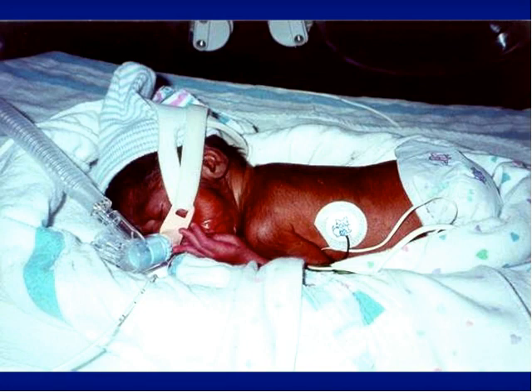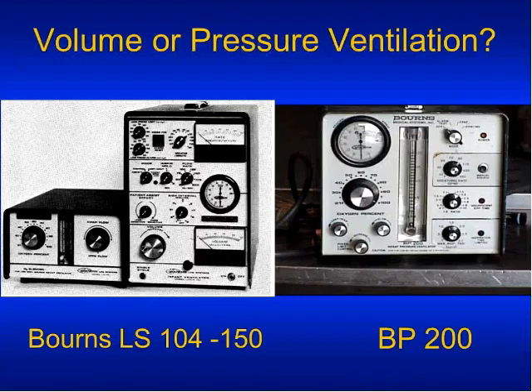Because one thing that most folks are very much convinced of is that the best way to avoid ventilator-induced lung injury is to avoid mechanical ventilation altogether and provide non-invasive support. We're not going to talk about non-invasive support today, but that is in fact first-line treatment when babies are sufficiently vigorous to do that.